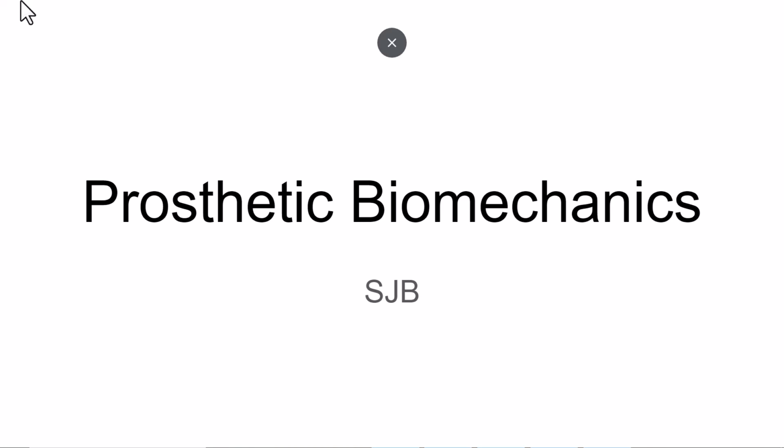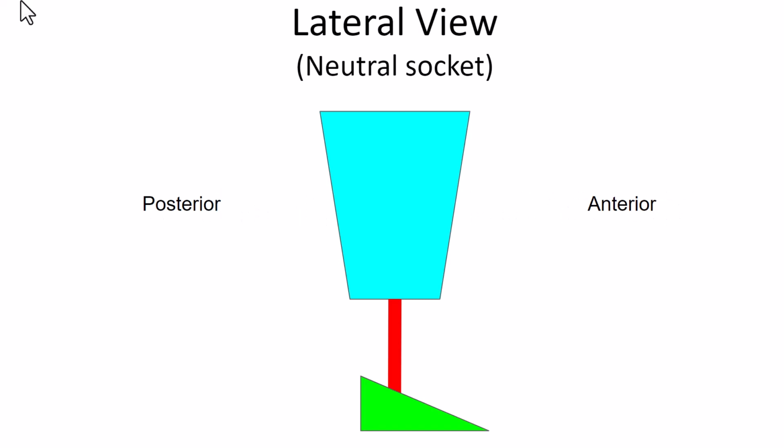So this slide presentation is an overview of prosthetic biomechanics, and it's also going to introduce you to some basic prosthetic adjustment terminology. What you see here is a lateral view of a transtibial prosthesis. This is considered a neutral socket because the socket here is directly over top of the pylon, which is directly over top of the foot.